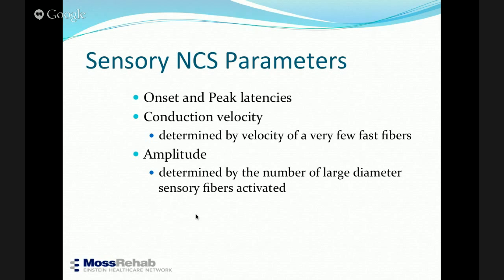And amplitude is determined by the number of large diameter sensory fibers activated. It does not show you the small fibers. Small fibers are going to be very slow, and that does not contribute to the amplitude of the response. Okay, it's going to be much later which comes in, and you have to look at a very high gain and average the response to be able to see those small sensory fibers.